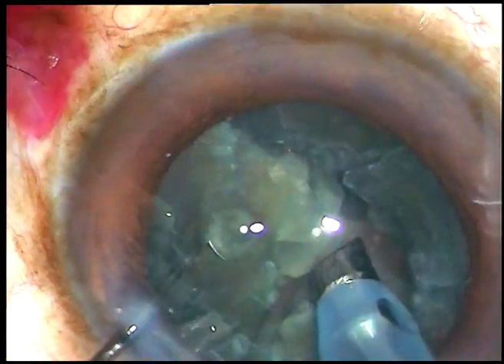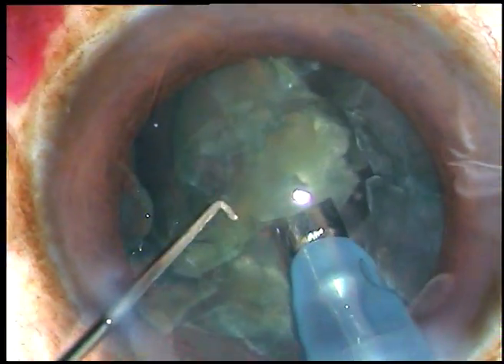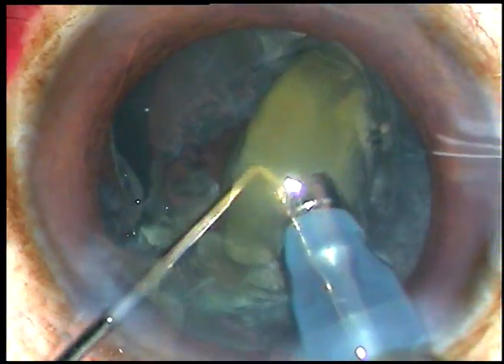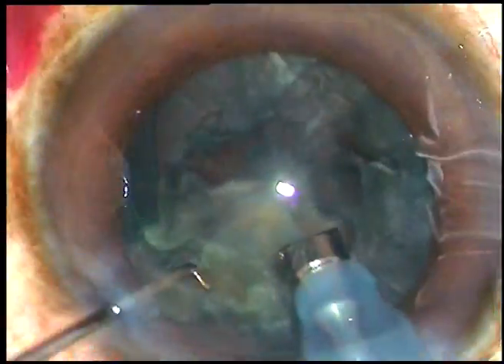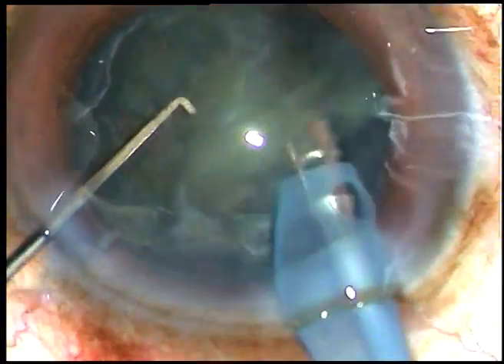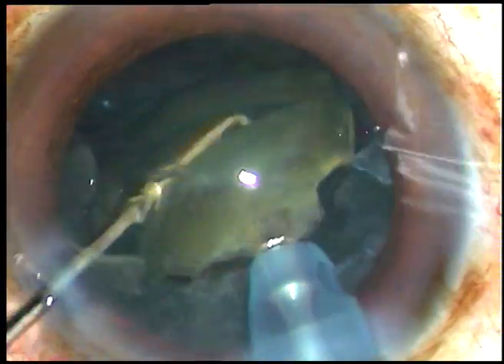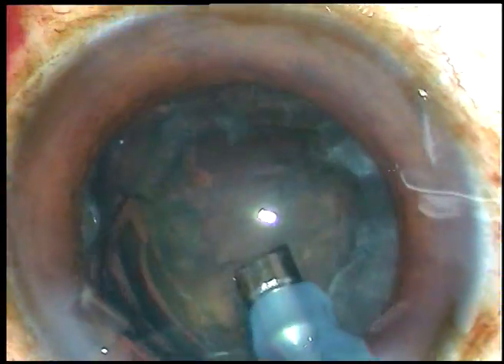I am in phaco-2 mode from the very beginning. Phaco power used in this case is 60%. Flow rate is 45 ml per minute. Vacuum is 450 mmHg. This is the Oertli Cataris 3 phaco machine — it is a beautiful machine with beautiful hold.